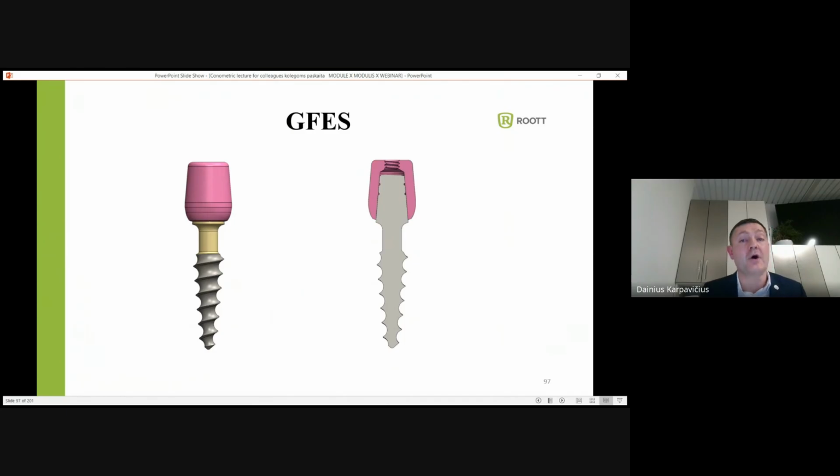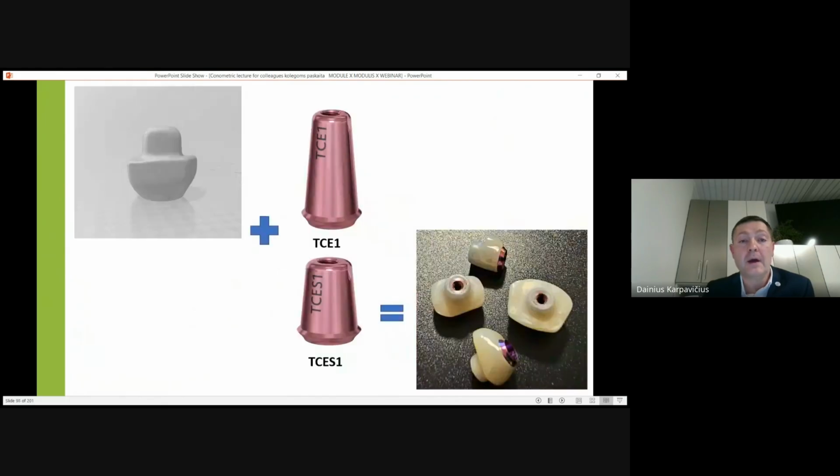Shortened gingiva formers, for cutted compressive C abutments. All the same are available for K abutments as well, because K abutments are 5 millimeters, and a cutted abutment of the monolithic implants, if you cut 2 millimeters from 7 to 5, will be more or less the same length like a K abutment.